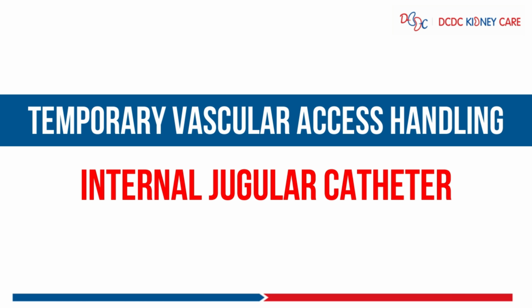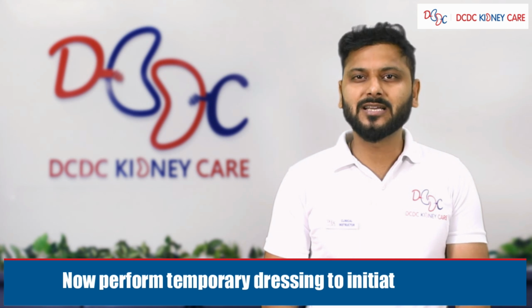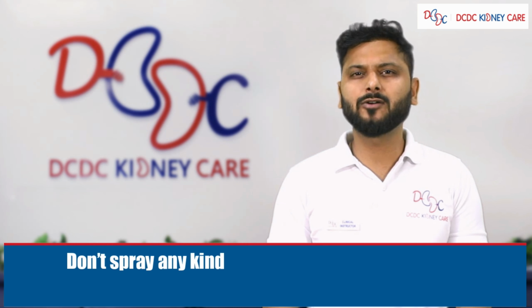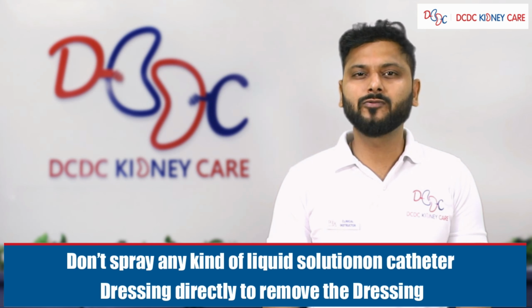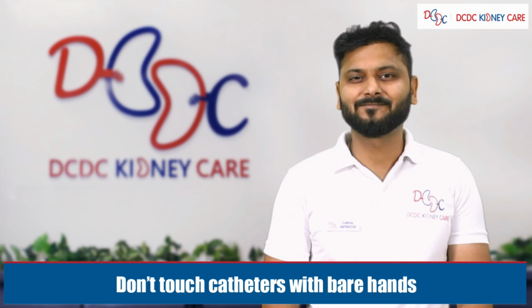Temporary vascular access handling. Internal jugular. Now perform temporary dressing to initiate dialysis. Don't spray any kind of liquid solution on the catheter dressing directly to remove the dressing. Don't touch catheters with bare hands.